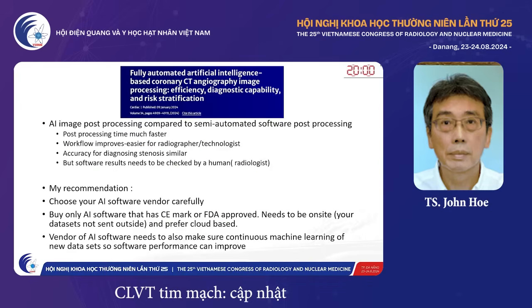This is a paper published earlier this year in European Journal of Radiology from a group from China. AI post-processing compared to QCT software. Post-processing time much faster, workflow improves. Accuracy for diagnosing stenosis is similar to QCT, but again, the software results need to be checked by a radiologist.